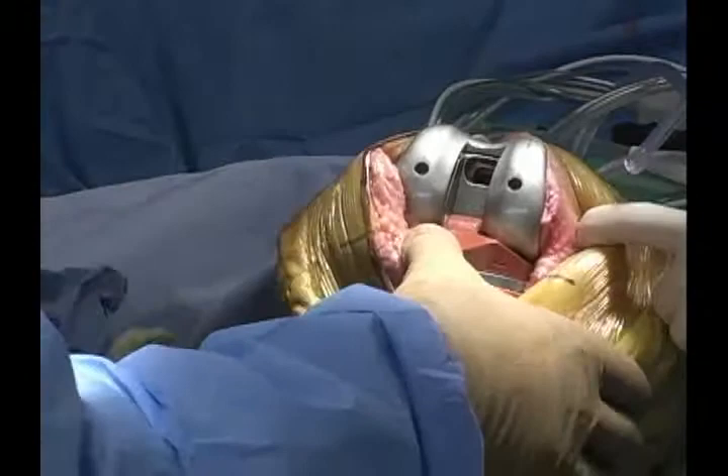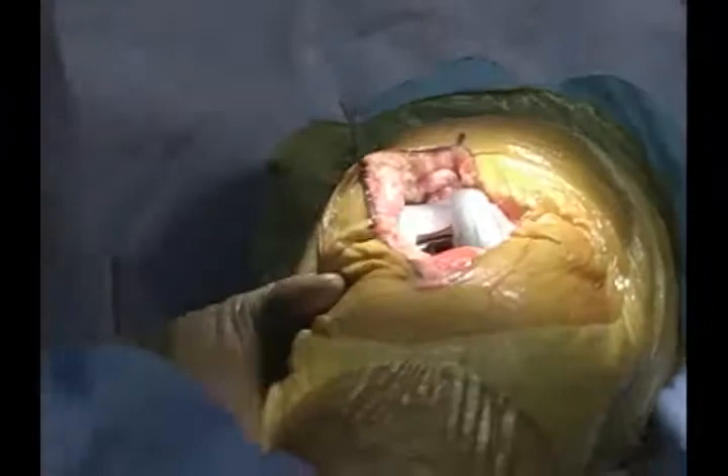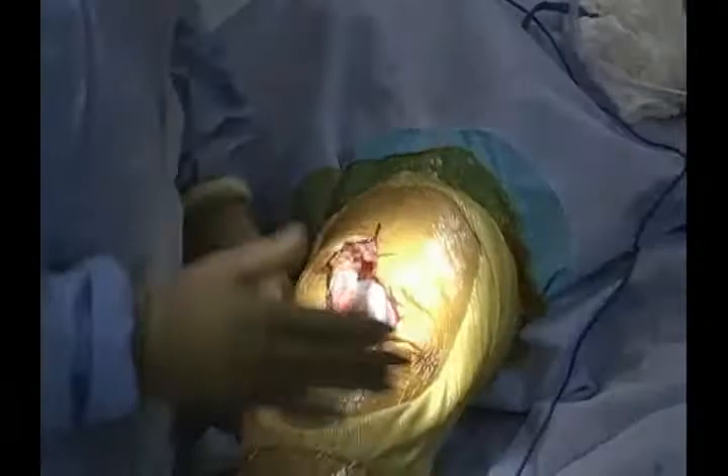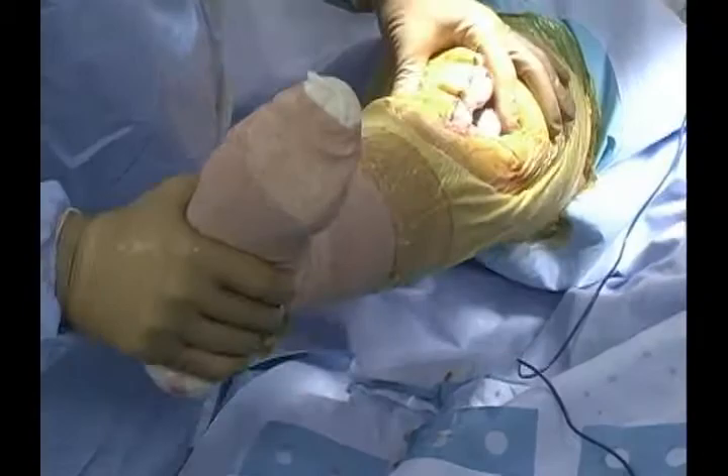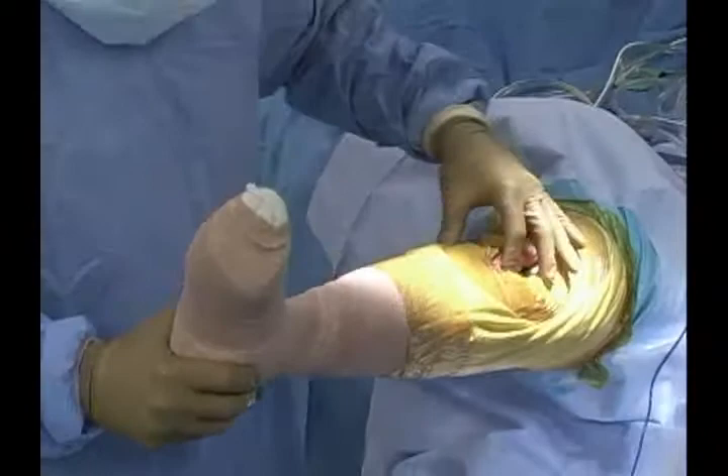We've rotated the tibial insert into place and can assess the flexion space. It does not seem excessively tight and is very well-balanced both medially and laterally, in about 30 degrees of flexion — also very well balanced. That's a good estimation of our joint line prediction. We then want to make sure the knee achieves full extension, and as you can see, we've easily achieved full extension. In extension, the knee is extremely stable.